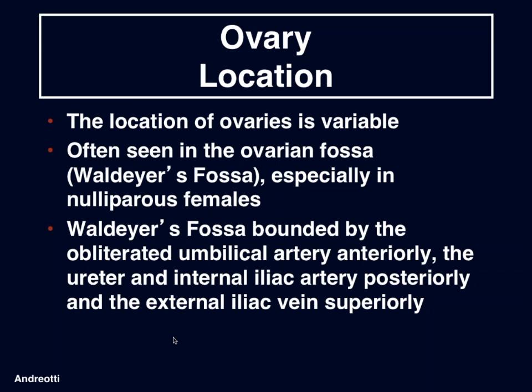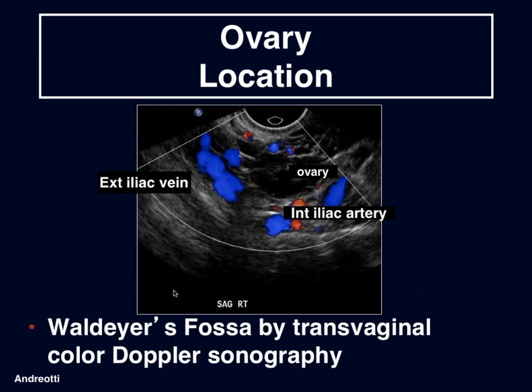external iliac vein superiorly. So here we have a nice sonographic depiction of Waldeyer's fossa. Here's the ovary, which is bounded posteriorly by the internal iliac artery, and superiorly by the external iliac vein.